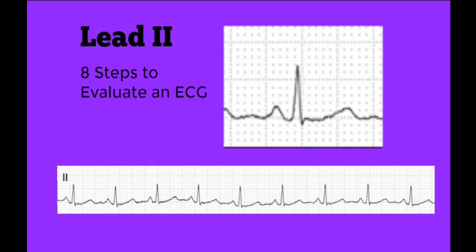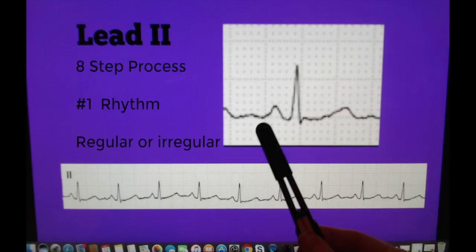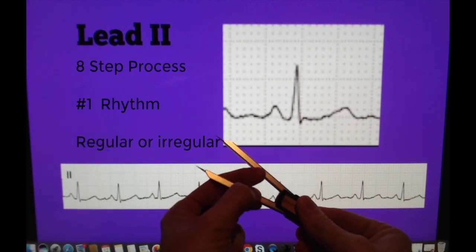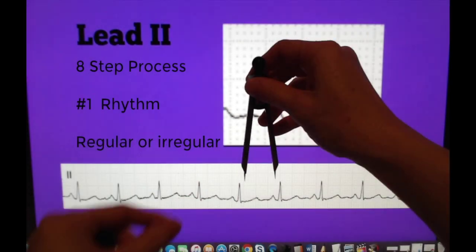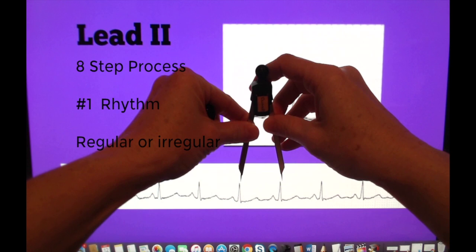Excellent, so we are now ready to go into our eight steps to evaluate an ECG. Step number one: rhythm. We want to know if our rhythm is regular or irregular and to do this we will use a set of calipers and we measure from the R to R wave.